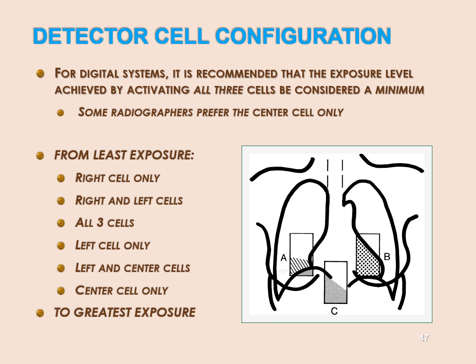That's why it's ridiculous. And he goes on, and the whole time I was like, really? Your diagram isn't even to scale. The scale of that human lung to that AEC chamber is out of whack. Either the lung is very, very tiny, or you have a giant ion chamber.